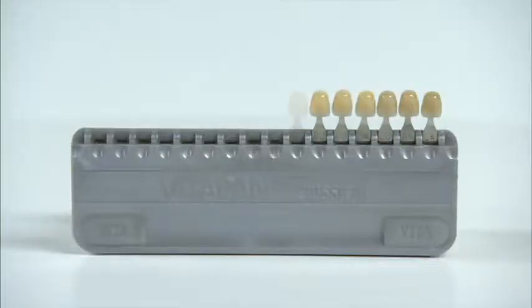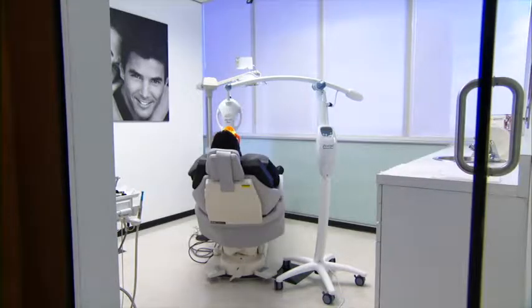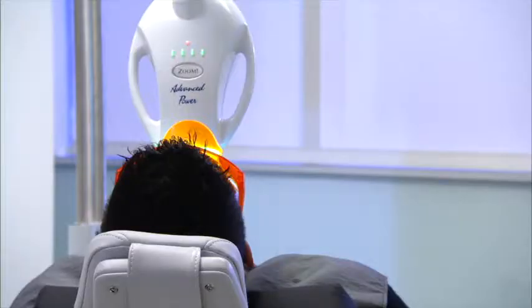For patients darker than A3, or if it's deemed necessary, a 4th session is available. Be aware that additional sensitivity may occur and patient comfort should be assessed and taken into account.